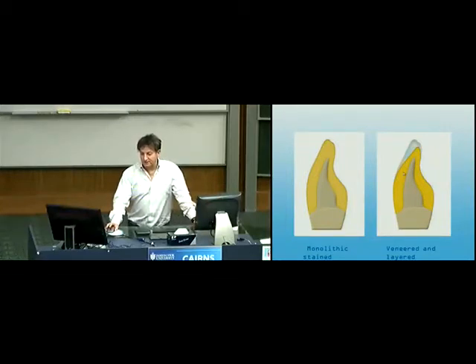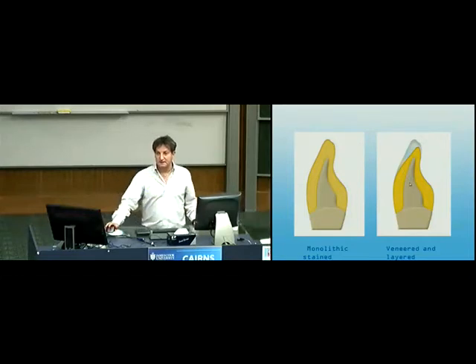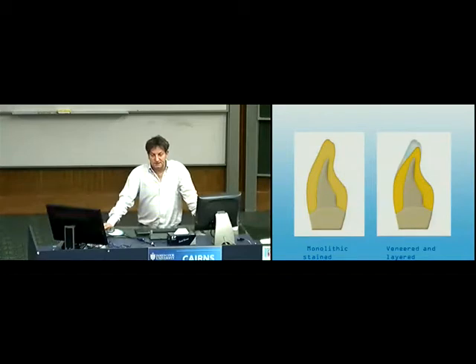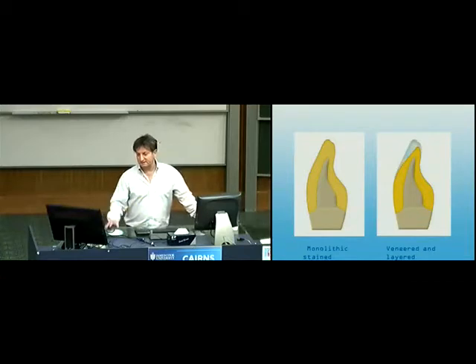This technique is a great one, veneered and layered. If you veneer Emax for an anterior restoration, you're going to get something very, very beautiful. Harder to make, more time involved, but this needs a big human component. This is the type of restoration which will look excellent.